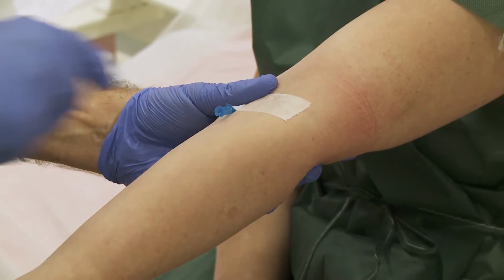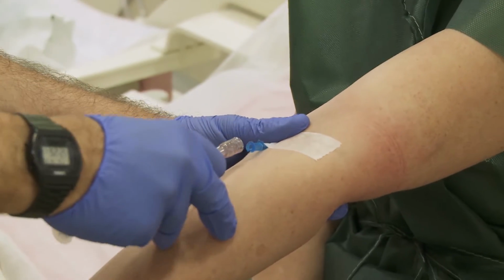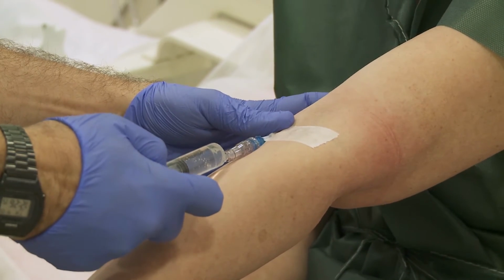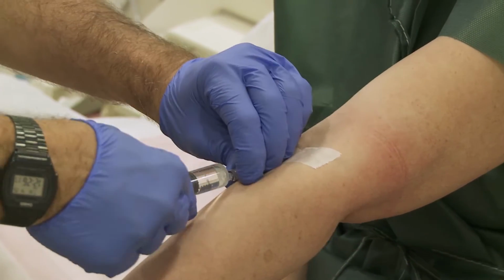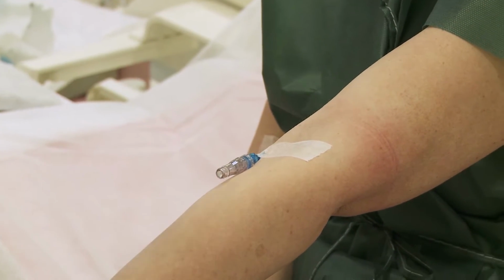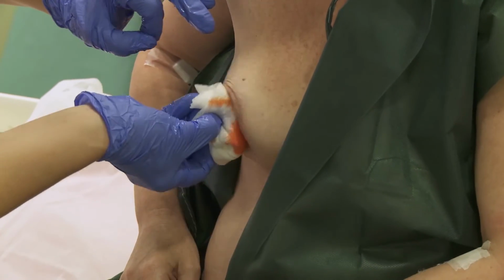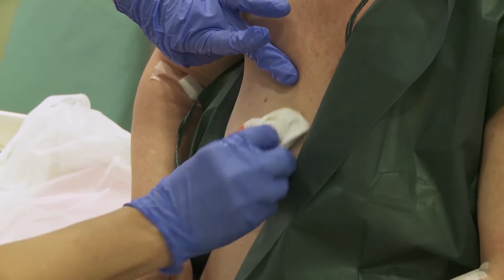The vessel is prepared for contrast media injection and saline is injected to check vessel permeability. Breast skin is disinfected.